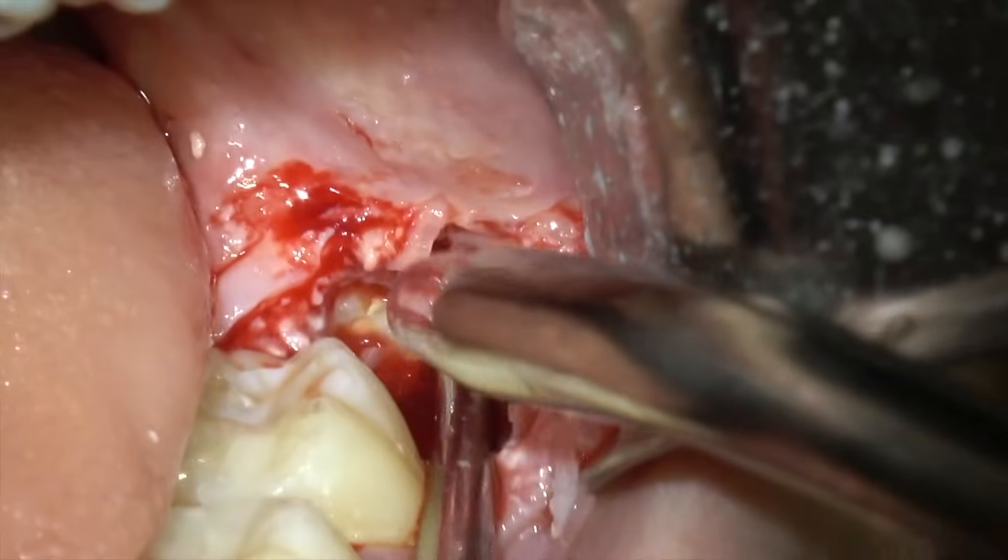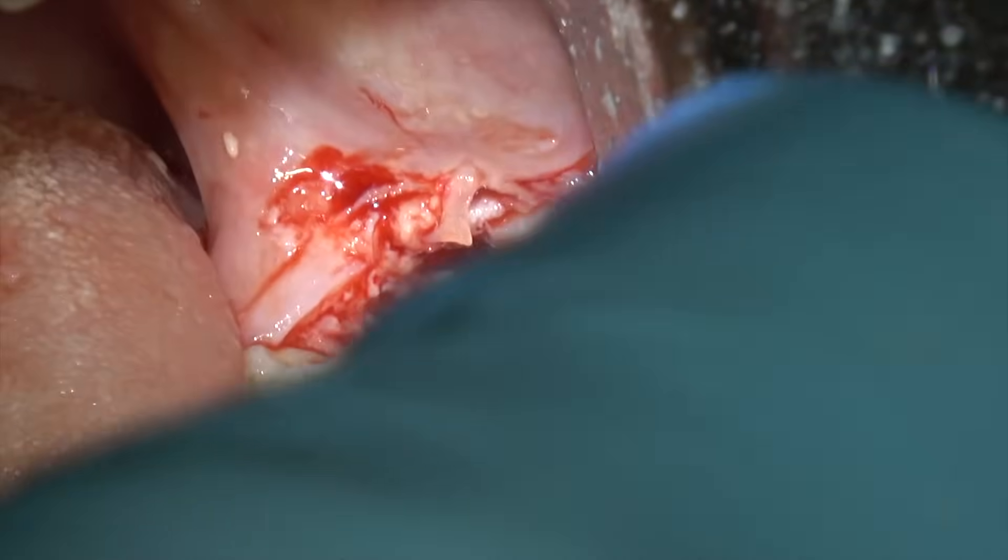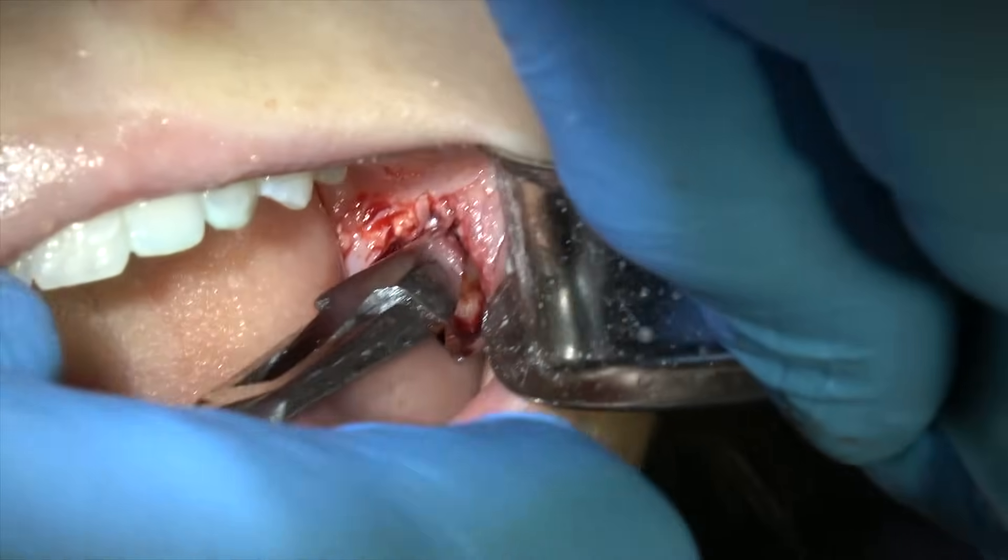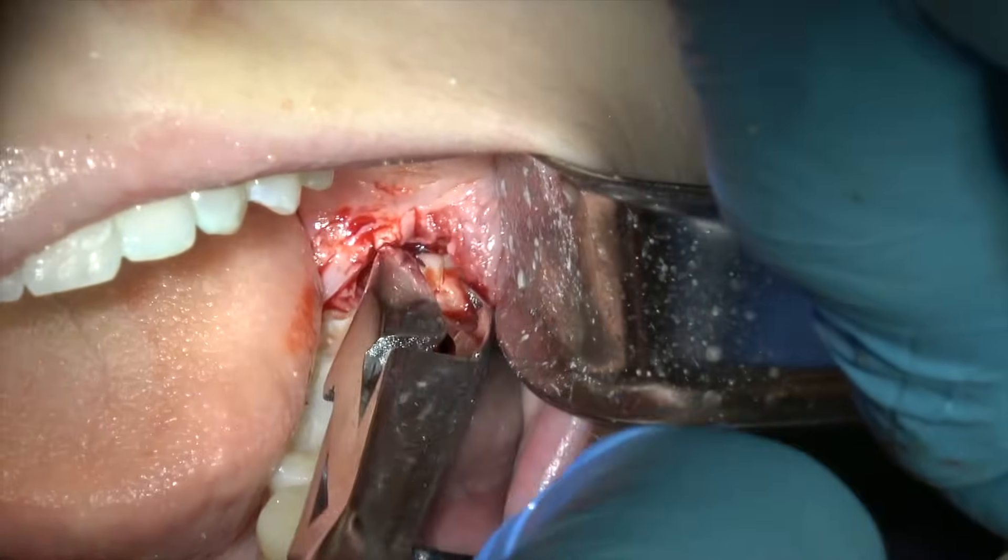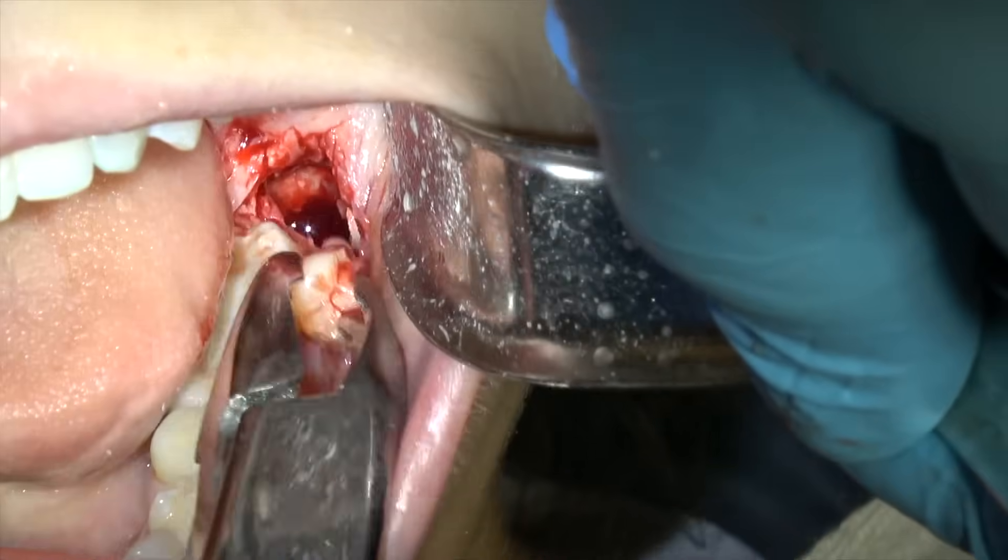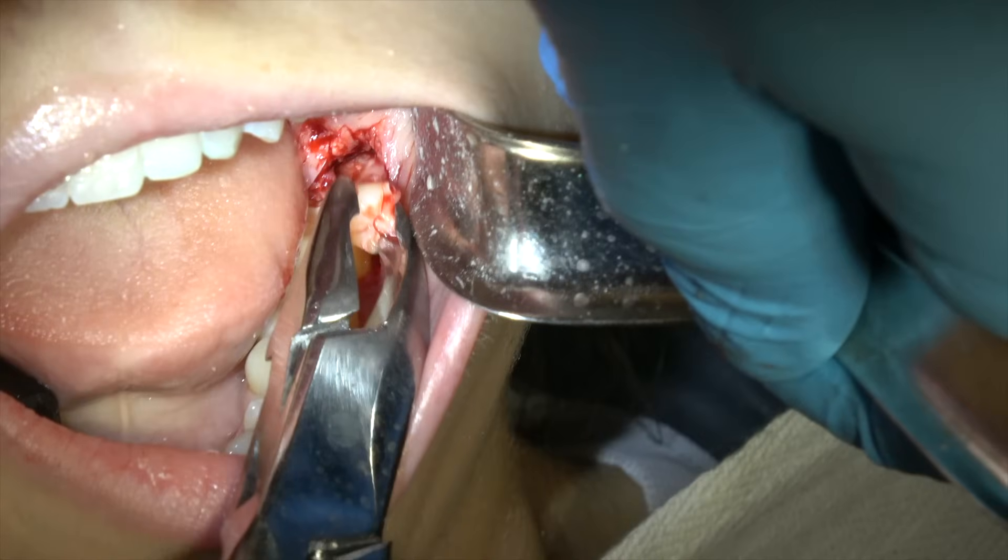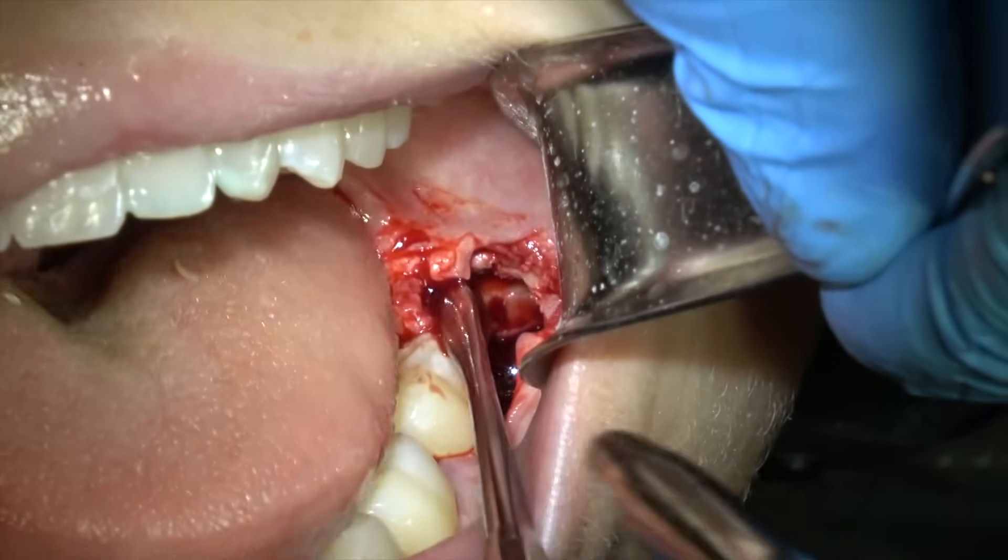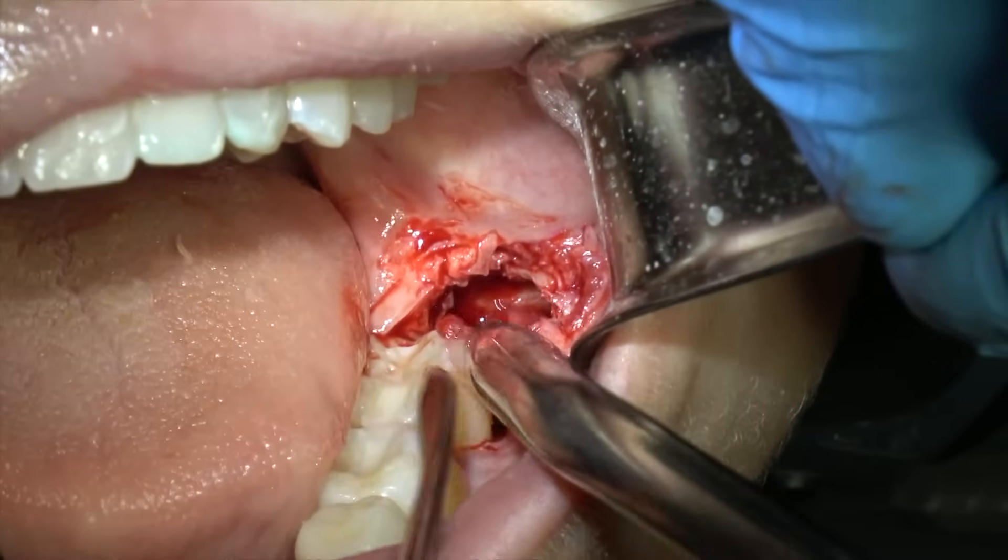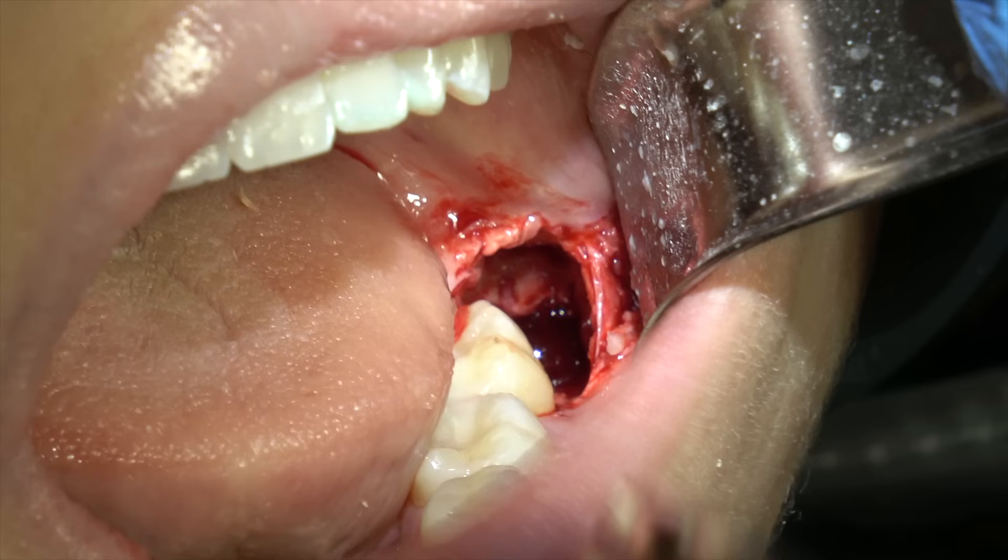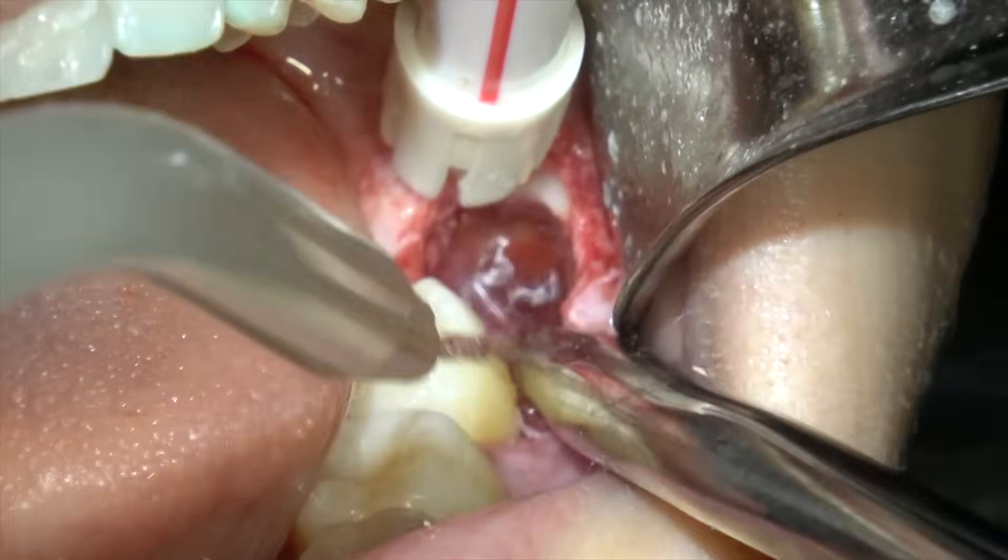And I've also separated the distal root from the mesial buccal and the mesial lingual roots. So I'm going to have three pieces here. Let's see them moving. And here come the other parts. Just be patient. Now I've really removed very little bone. I've mainly cut the tooth into pieces and lifted those out in three parts.